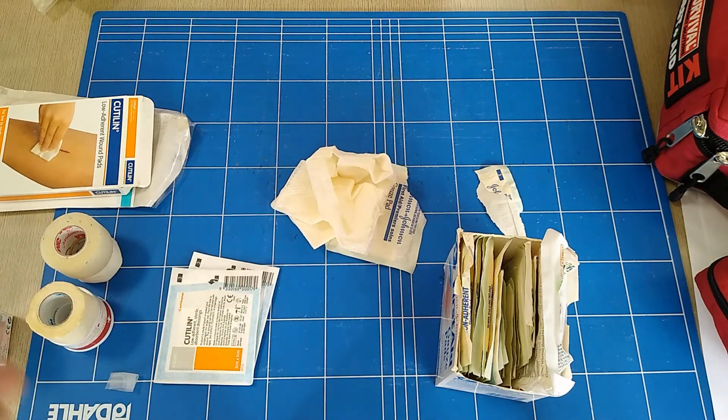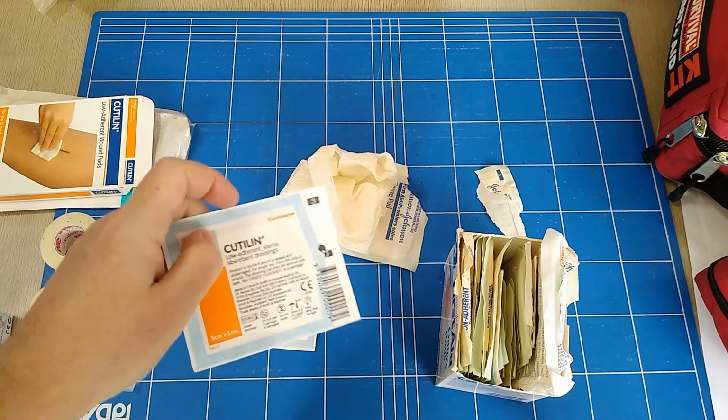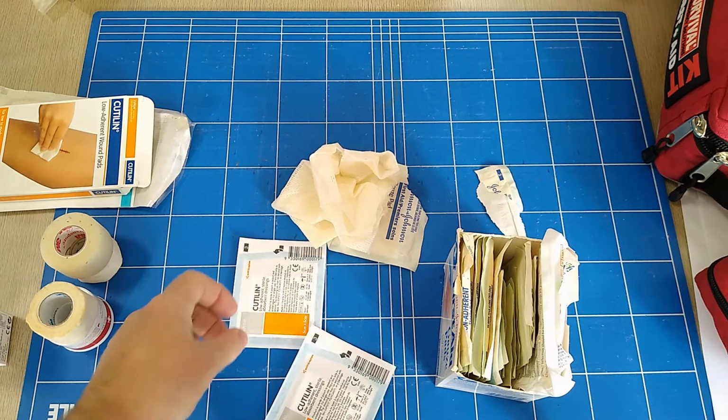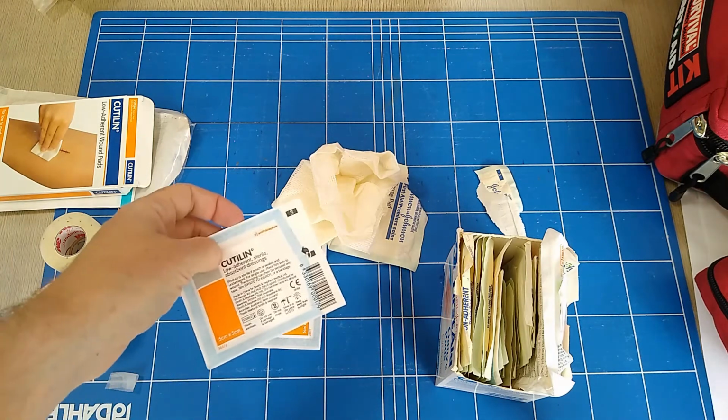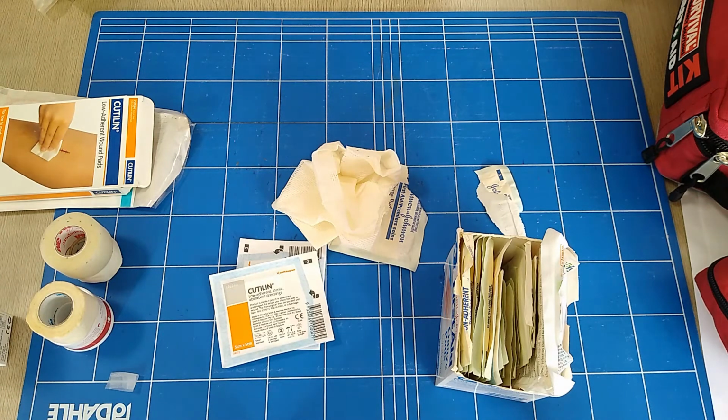In general, for most wounds, if you put that low adherent pad on top first and then smash a bunch of gauze on top, it's going to have the same effect, but it's going to be a lot easier for them to remove at the hospital. That's not going to be all down in the wound. Also, most first aid courses have this weird thing where you're dealing with super serious things that no one ever deals with, but you're not going to get the skills to deal with them. You're not going to learn how to pack a full depth wound, but also you're not going to get taught how to handle a small cut, because they don't have time for that.